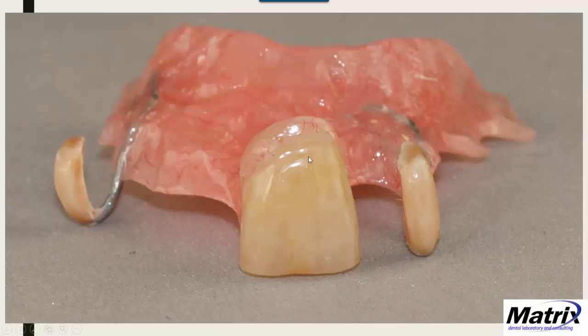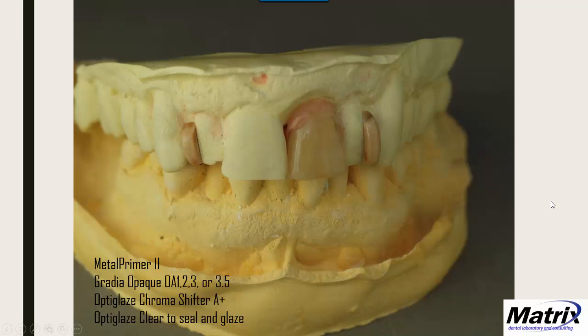Here's a close-up showing the finished result — I added a little orange from the OptiGlaze for character. It's a provisional so I'm always testing, experimenting, and learning. You can see it has character, with little dark areas added too. This is going to look a lot better than an exposed ball clasp. The full process: airabrade first, metal prime, apply opaque, use chroma shifter to bring the shade to match the tooth, then clear to seal and glaze. Those will hold up really well.